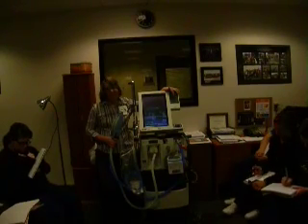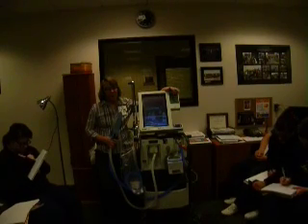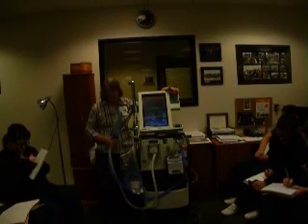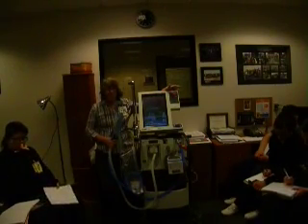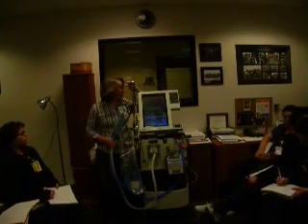Low priority might be like a minute ventilation alarm. A medium priority would be maybe a tidal volume. I can't remember which ones they classify as medium priority. But obviously low is not as urgent as a high priority. So as you hear the different sounds, you'll know whether you need to go into your room urgently or not to see what's going on.